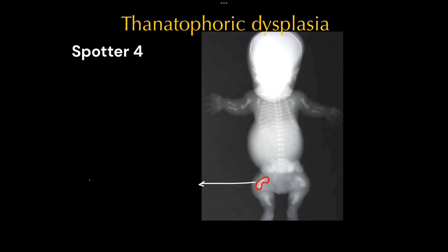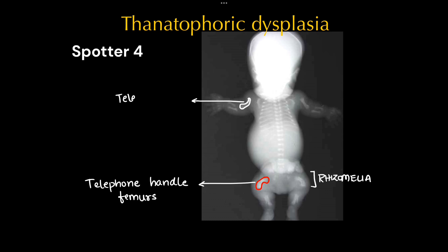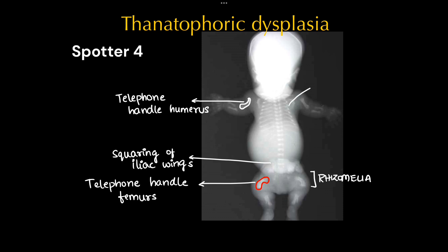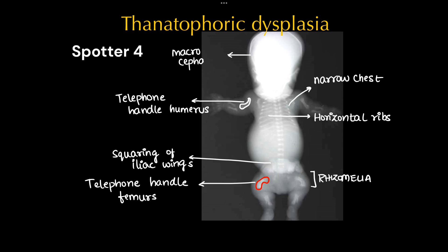This is a case of skeletal dysplasia — thanatophoric dysplasia — where we can see telephone handle long bones. The femurs show a telephone handle appearance with shortening of the proximal limbs, that is rhizomelia, and the humerus also shows telephone handle appearance. There will be associated squaring of iliac plates, narrow chest with horizontal ribs, macrocephaly, and platyspondyly as a finding in the spine.